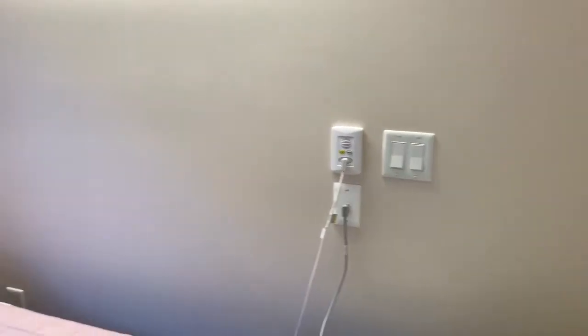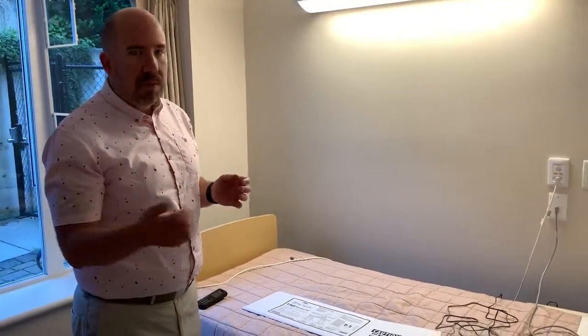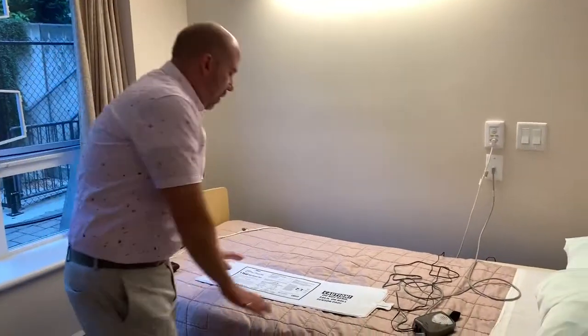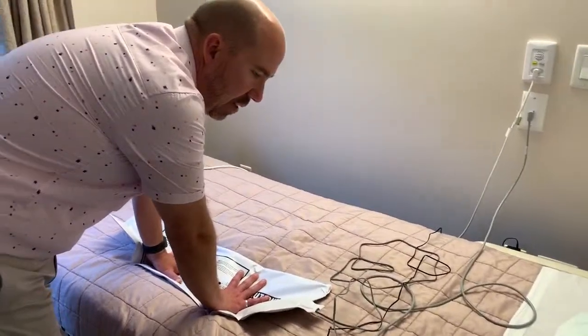So let's say that you want to actually transport a resident, they're in the bed, you want to take them for an activity, a meal, what have you. They're laying in the bed. So I'm going to mimic that. So I'm in the bed right now. You come in and you take care of the resident.